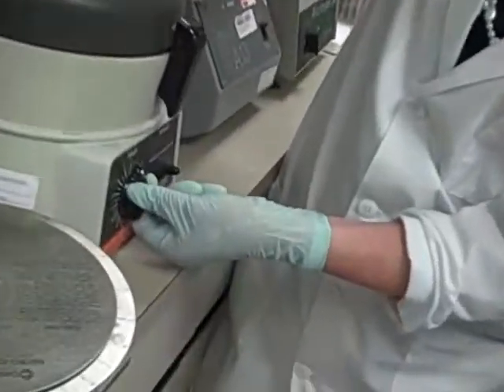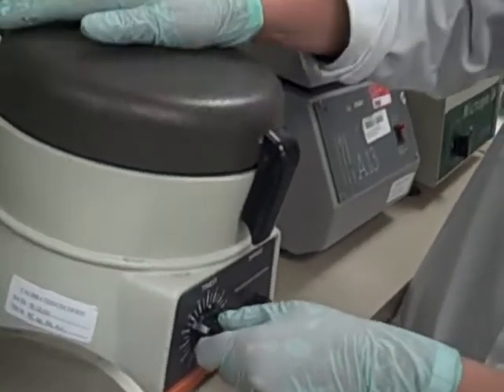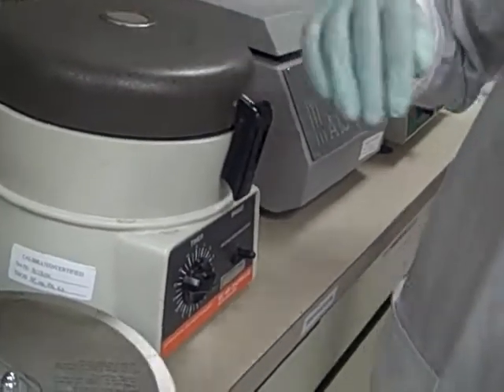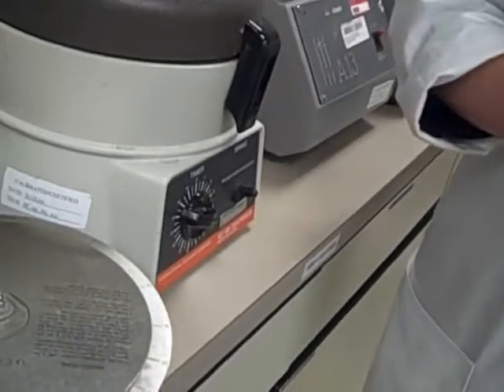So let's start the timer for five minutes. And we'll come back in five minutes and pull our tubes out.